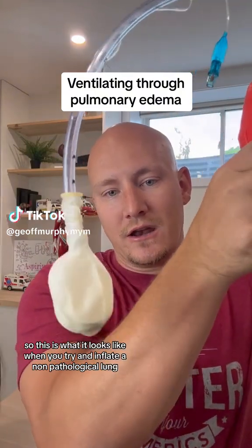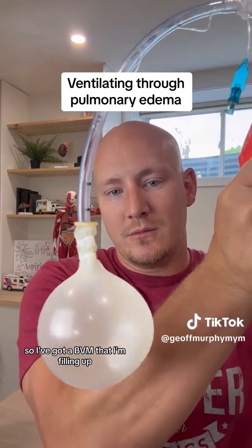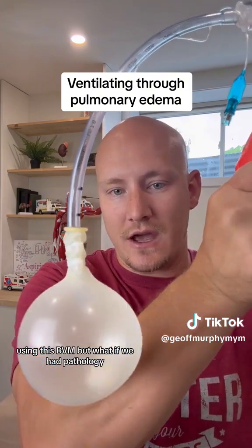This is what it looks like when we try and inflate a non-pathological lung. I've got a BVM that I'm filling up, and you can see that it's quite easy to fill up this balloon with air using this BVM.